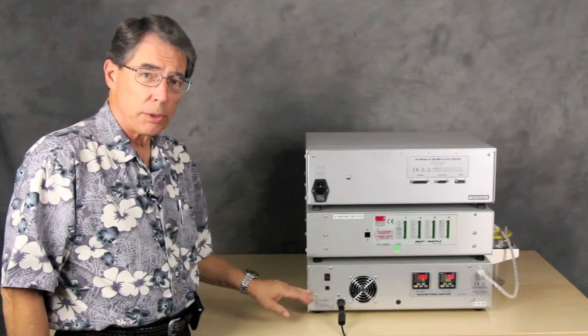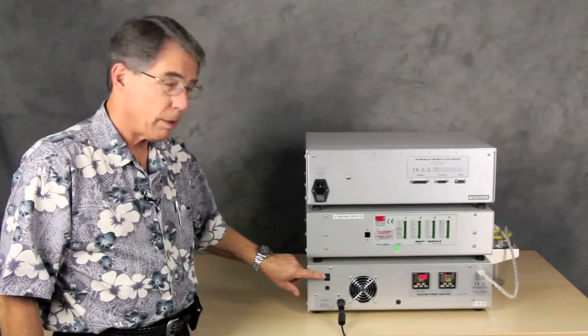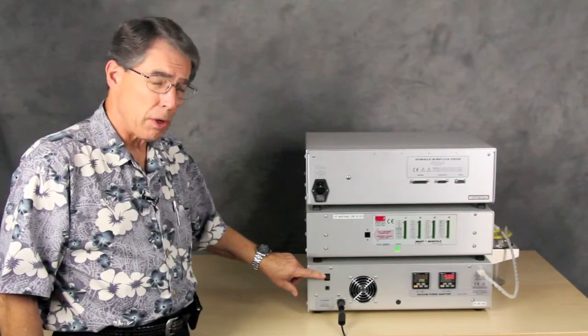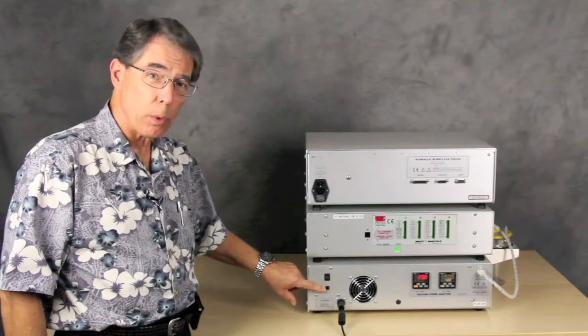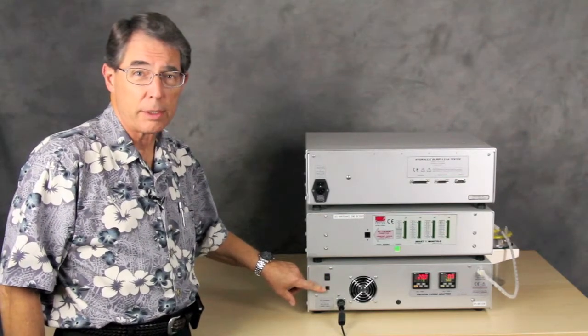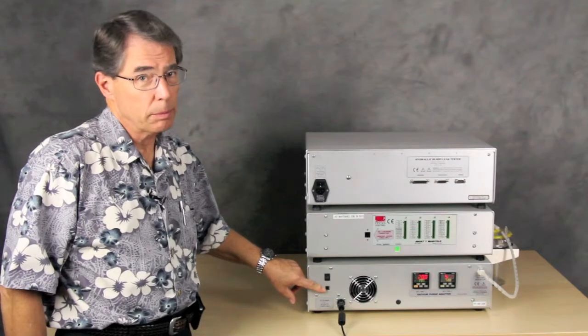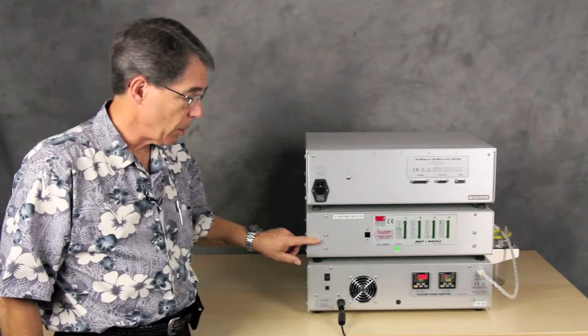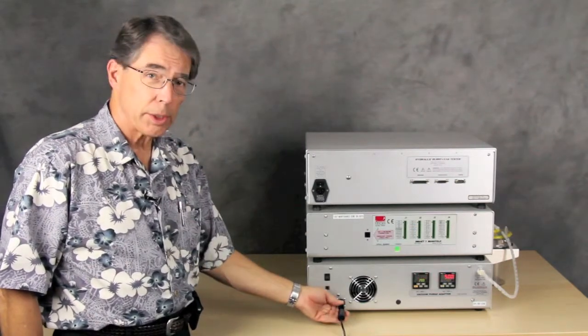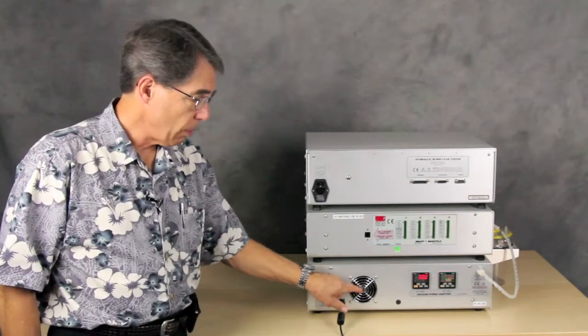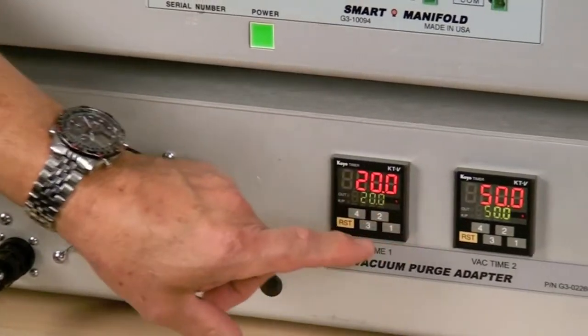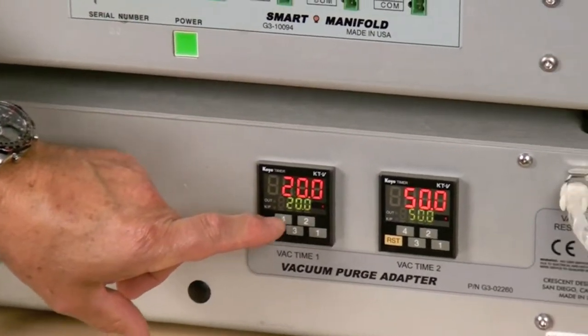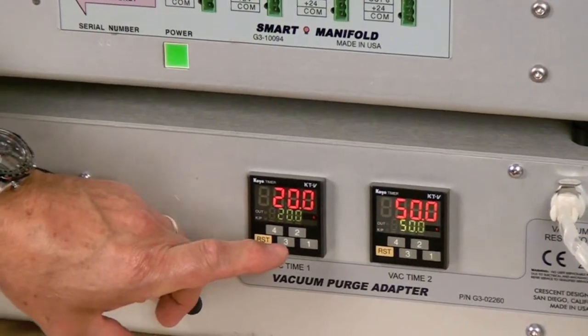Now we've turned the unit around so you can see the rear. Here we have the power switch for turning the unit on and off. We have a USB port that allows you to connect it to LabGenie, which provides even additional functionality along with the HBLT and the Smart Manifold. The power connection, cooling fan, and here are the two timers that are started from the front of the unit.